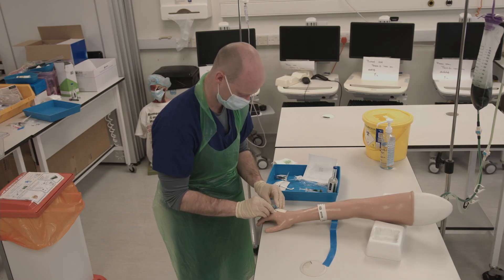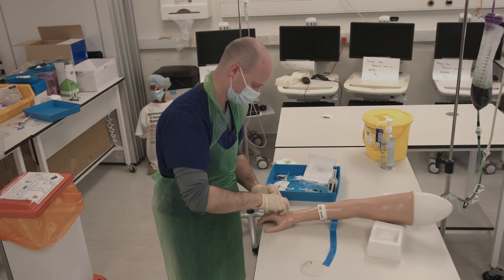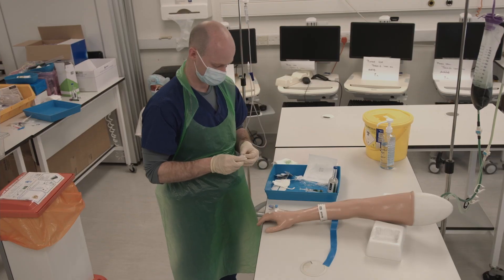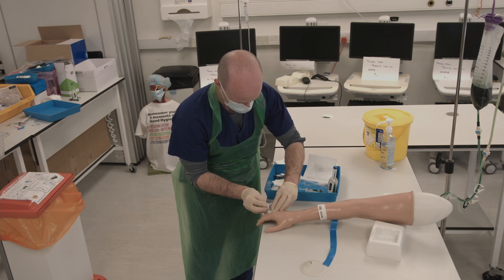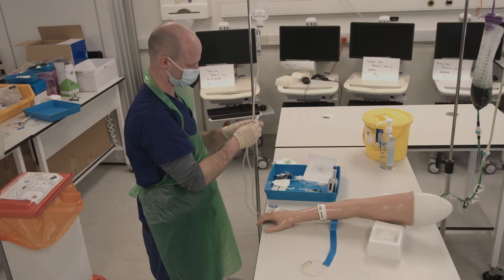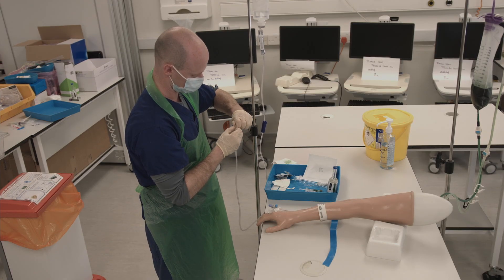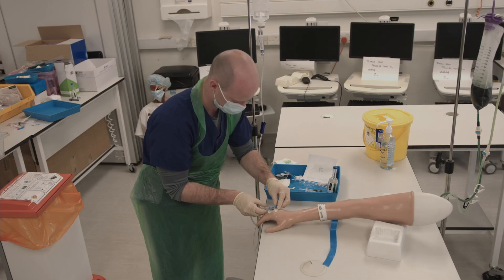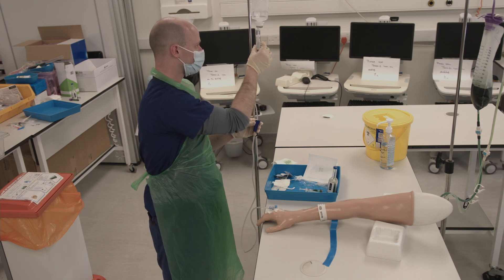You can now apply the label to the bottle. Clean the end of the bung once more with a chlorhexidine wipe, then remove the cap from the end of the infusion tubing and attach to the bung by twisting clockwise. Release the roller ball and look for drips in the chamber of the giving set. The rate of infusion can be calculated via the drip rate.